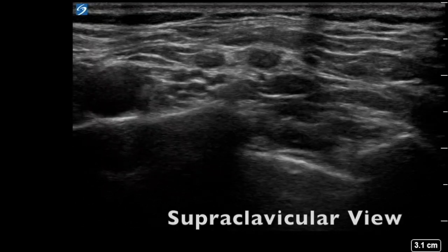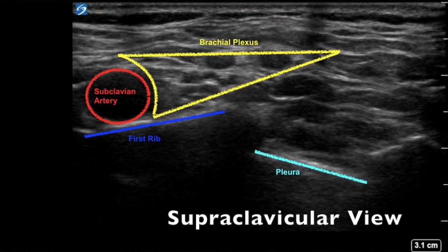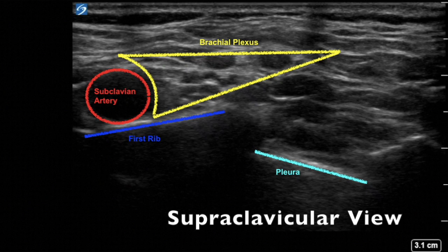Generally it's easiest to start scanning in the supraclavicular fossa. Here we have the supraclavicular view of the brachial plexus. As you can see, the brachial plexus is close to the subclavian artery, the first rib, and the pleura, and is often found in a grape-like shape in this region.